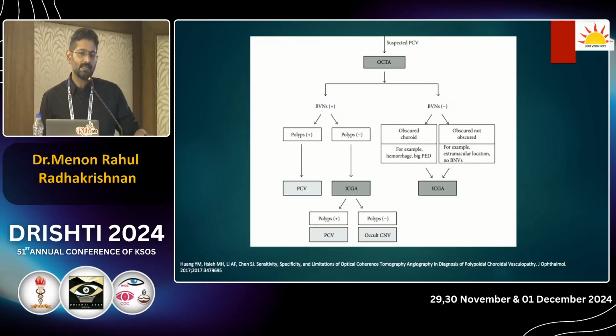So are we at a stage where we can throw away our ICG machines and solely depend on OCTA? No, we are not. But it does help our cause.